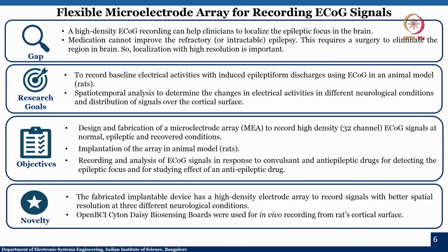So what is the gap? High density ECoG recording can help clinicians localize the epileptic focus in the brain. Right now we do not have that. Second, medication cannot improve refractory or intractable epilepsy, and this requires a surgery to eliminate the region in the brain. So localization with high resolution is extremely important.